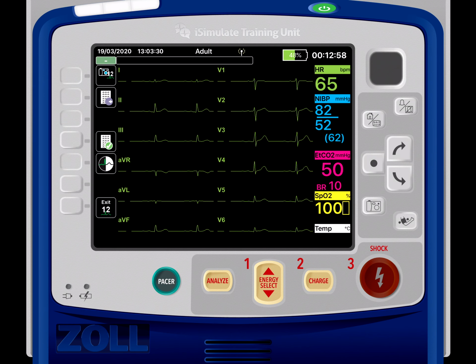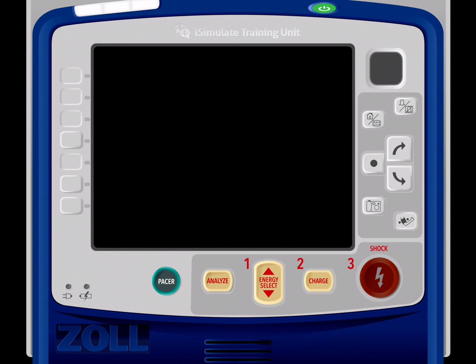And that would be the end of your dynamic cardiology scenario. So as long as you were able to effectively manage those 4 rhythms, you should be okay. I'll put up some other videos with some different scenarios, some symptomatic bradycardias, some tachycardias, so we can make sure you can go through those algorithms correctly. But as you watch these videos, just make sure you are verbalizing to yourself out loud or writing down, making notes of how you're going to treat each one of these scenarios.